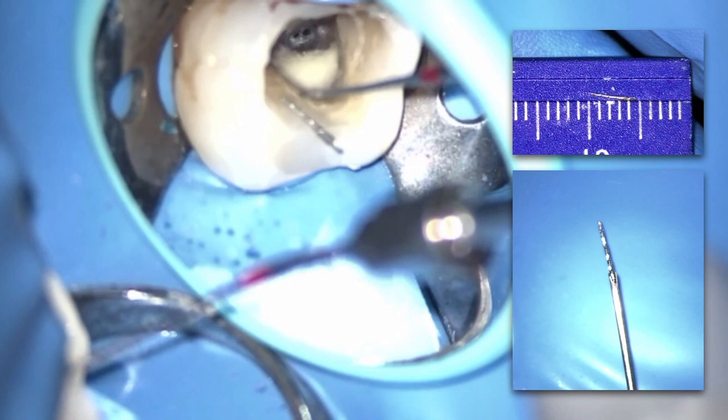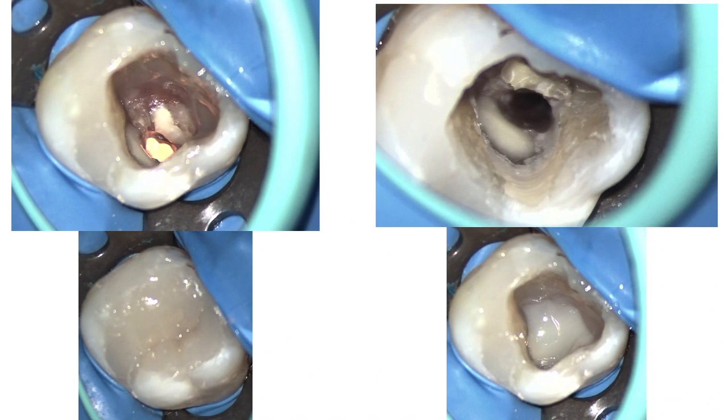So you see that I removed two separated files, here the first piece, here the second piece. So I finished the case, I shaped the distal canal also, and here you see that the area of the perforation repair is very clear after I do obturation. Then I put a coronal seal and then the final coronal seal.